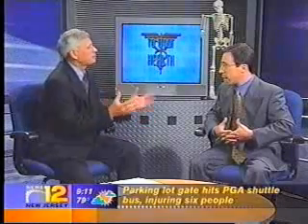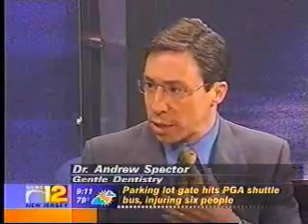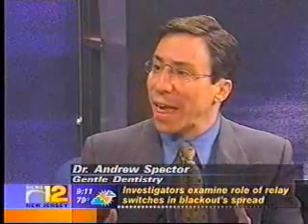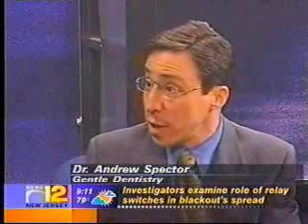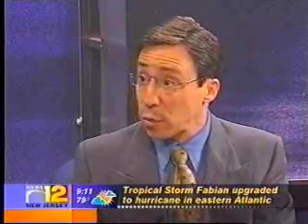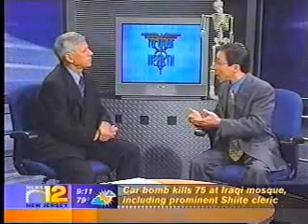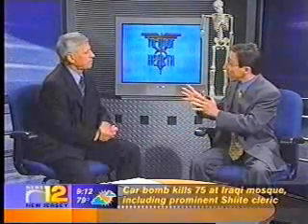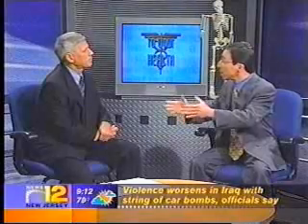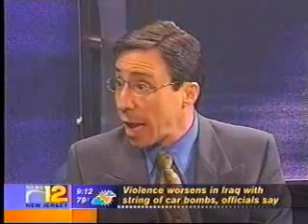What are the advances, because we know there's been so many in dentistry? What's the latest trend that you're using for making crowns or caps? What's happening in dentistry is two things. The materials are changing, and the way that the crowns or caps are manufactured is changing. In our office we're using CAD/CAM technology. Rather than taking that goopy mold or impression that you'd send to the lab and wear a temporary, you take a picture of the tooth. It sends it to a computer system, and we design the crown on the computer and then send it through a wireless connection to a milling chamber, and that chamber machines the crown out of a solid block of porcelain.